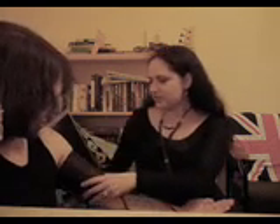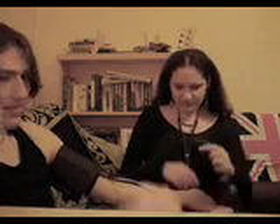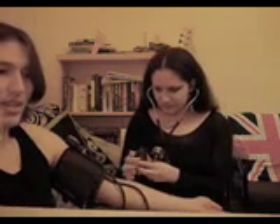It's not difficult to hear the Korotkoff sounds — I think that's how you pronounce it — the knocking. Not everyone attaches the spig to the cuff, but for me I think it's easier to look. The spig of course being this dial which indicates blood pressure.